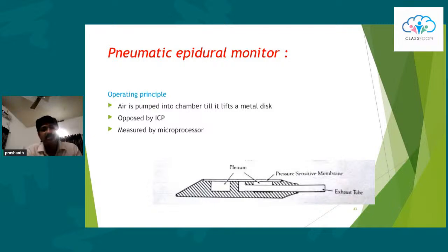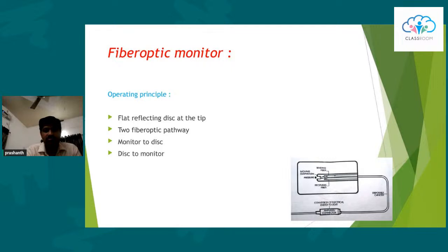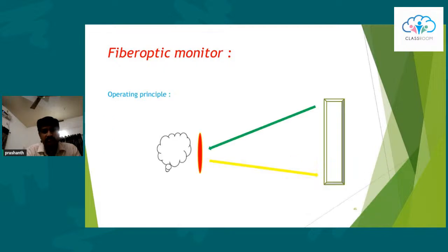The advantage of the system is that it is reliable, and can be used in multiple locations, that is intraventricular, subdural, epidural, or intraparenchymal.